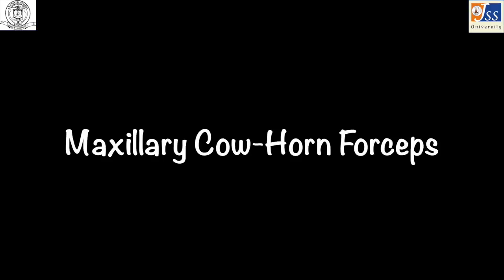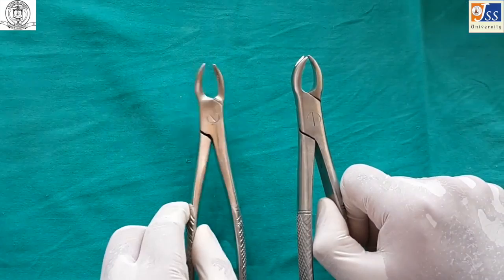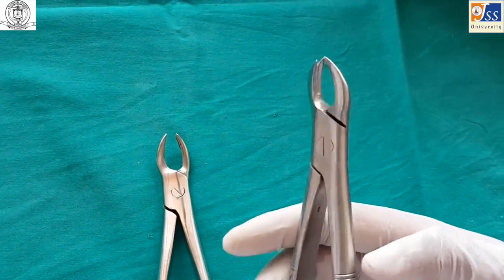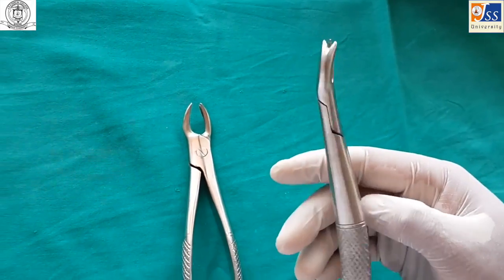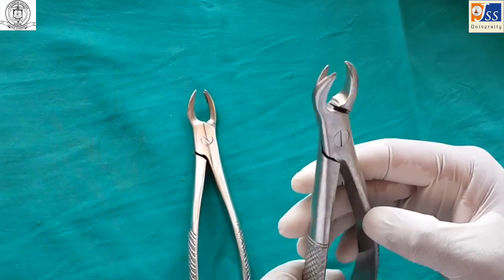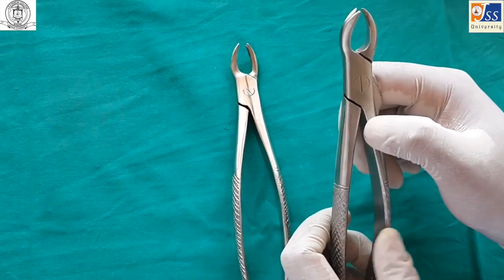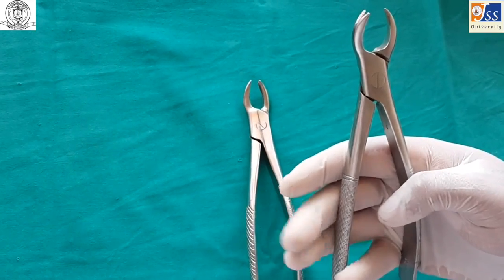Maxillary cowhorn forceps is used for maxillary molars and is a paired instrument — one for left and one for right side. It is especially used for extraction of grossly decayed teeth which cannot be gripped by maxillary molar forceps. There is a single conical beak which engages the buccal furcation area, determining the side of the forceps. The other beak has two prongs which engage the palatal root.